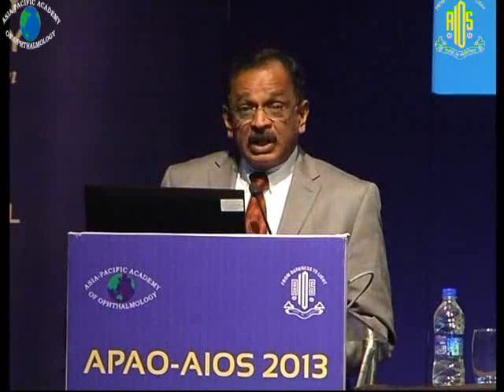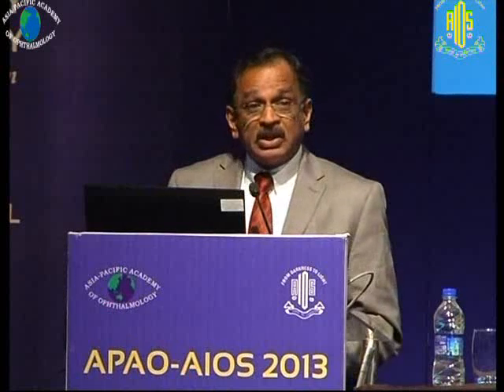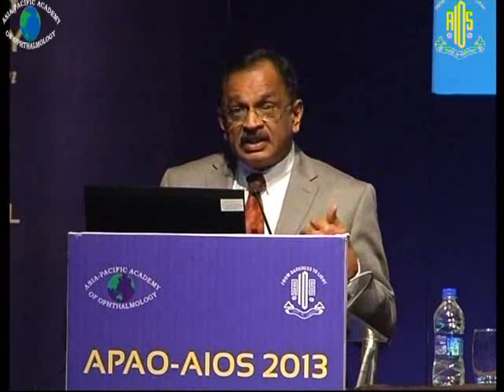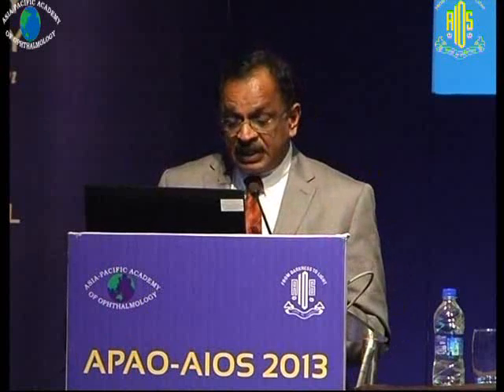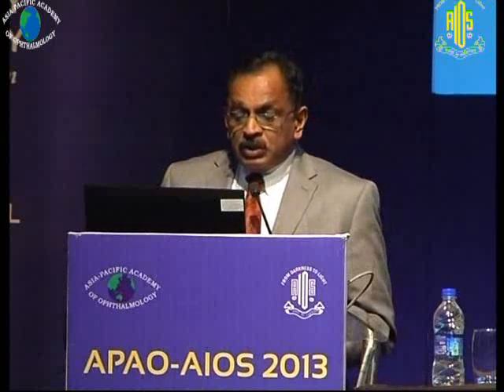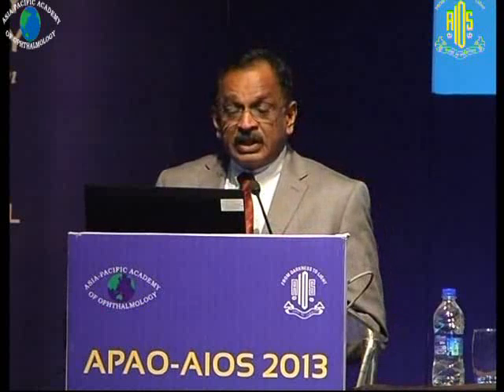Especially when the retina is not elevated, you have to be careful that you don't damage the underlying choroid because it causes bleeding. So ensure that that part of the retina is lifted before you cut the retina in these situations.